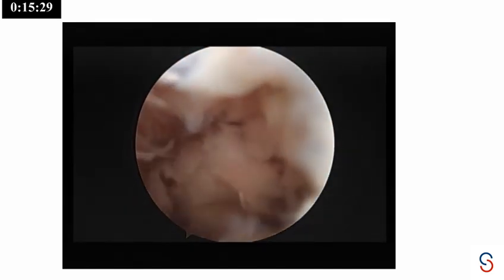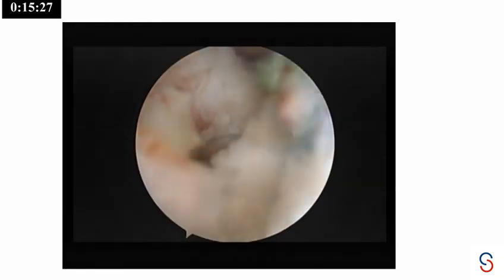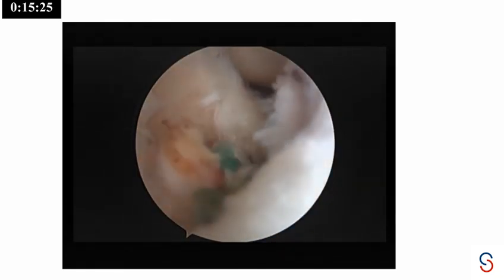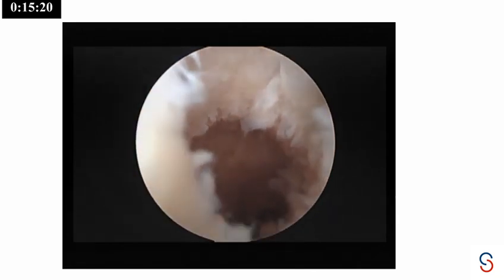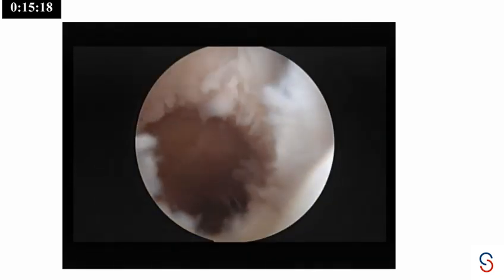On the tibial side, just cleaned off the soft tissue, took a curette and scraped off the margins. Didn't go to ream it, just left it at that. This was a huge irregular defect of the tunnel, and you can see this is an oblongated tunnel.